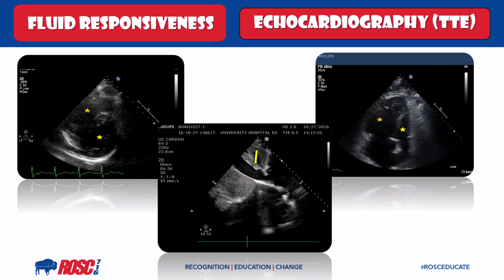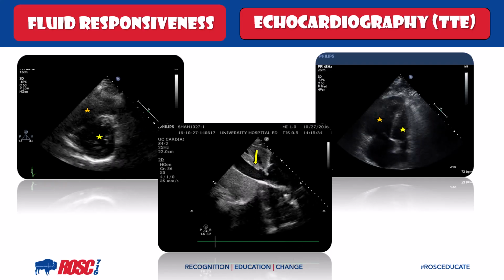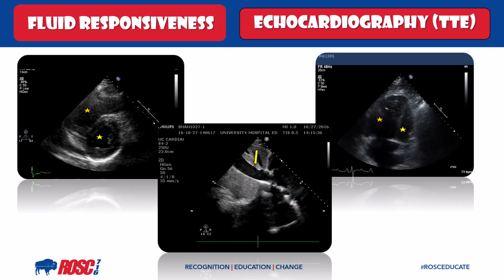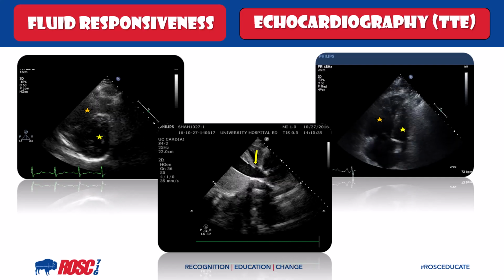And now we take a look at the IVC itself. This finding is what we would refer to as a plethoric IVC, a grossly dilated IVC. Chances are, given the appropriate history and clinical exam, these echo findings tell you not only not to give fluid, but that you might harm the patient by giving fluid.